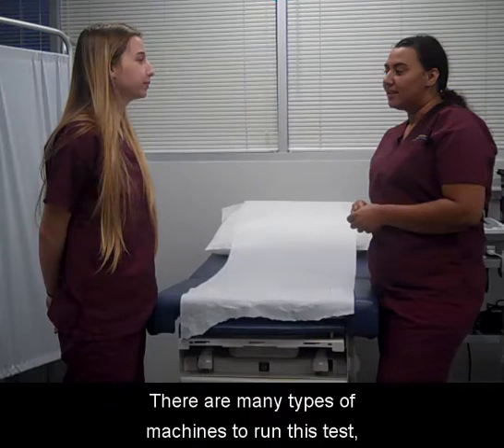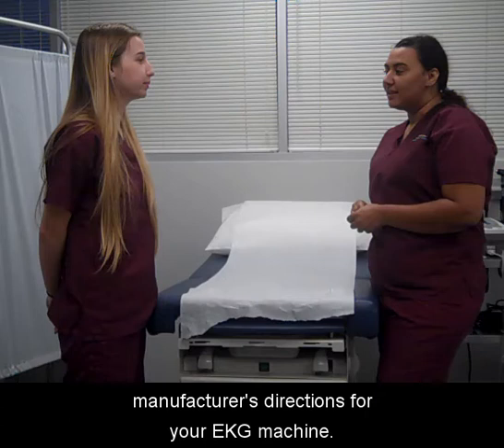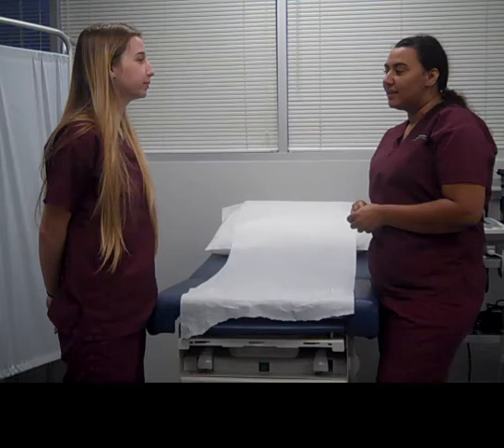There are many types of machines to run this test, so it is very important to make sure that you follow the manufacturer's directions for your EKG machine.